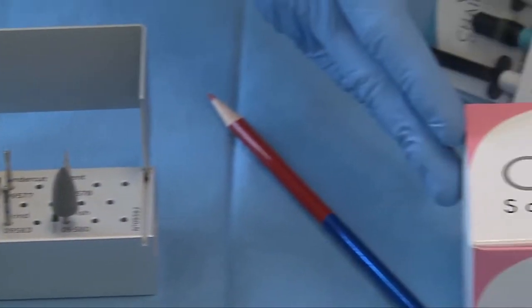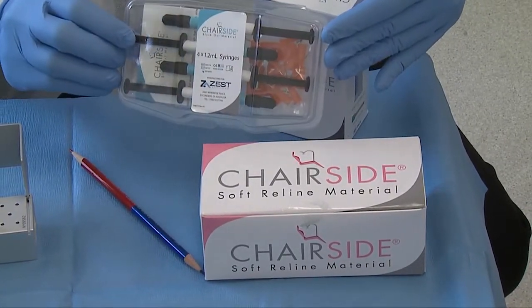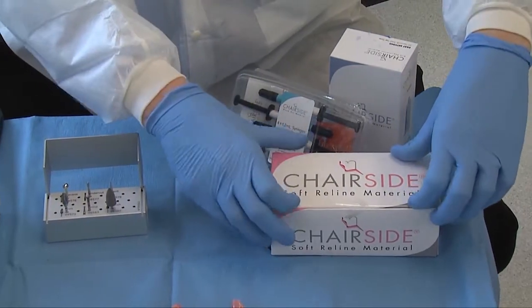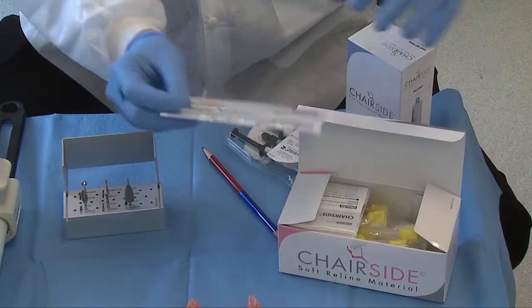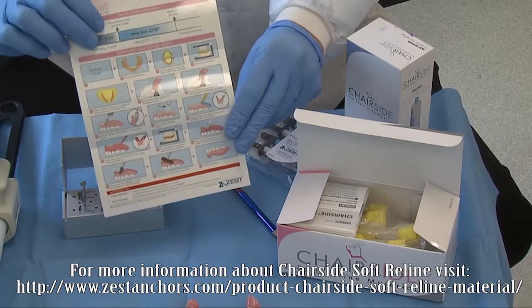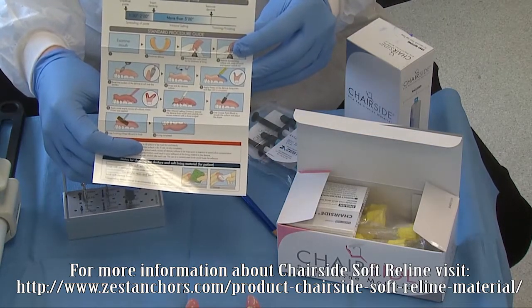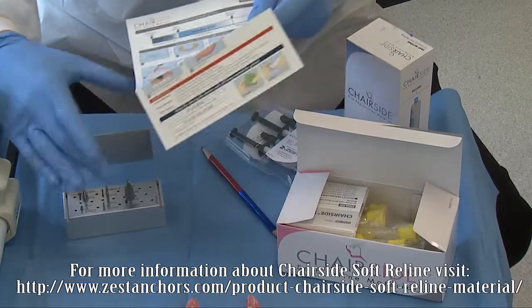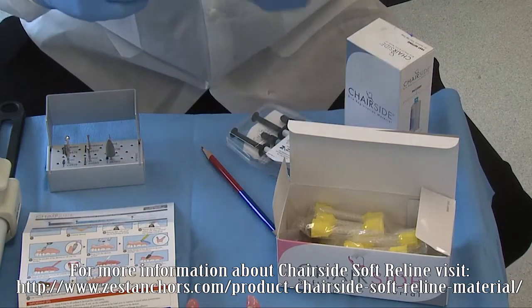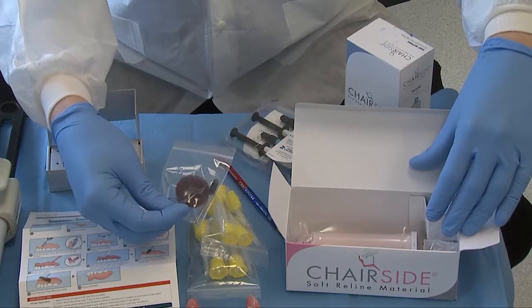All of our adjusting burrs are here on top, including our locator recess burr, undercut burr, and vent burr. All of the polishing burrs are down below. We also have our chair side soft reline material, block out material from the Zest chair side product line, and a bite registration material. We're going to be demonstrating these products today. Let's get familiar with the chair side soft reliner material.